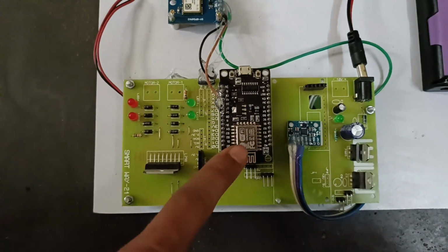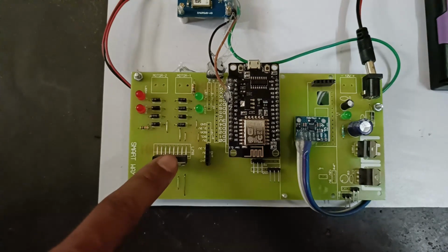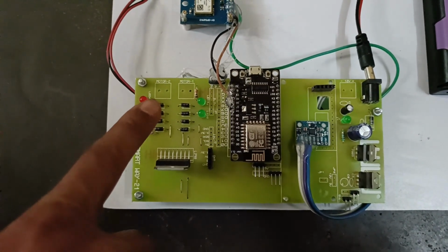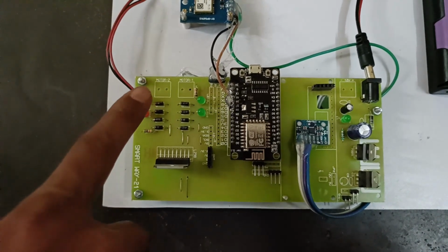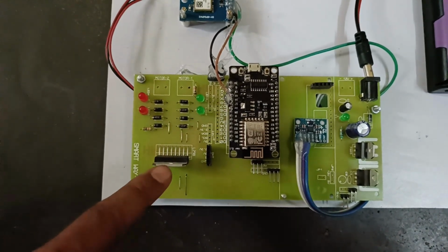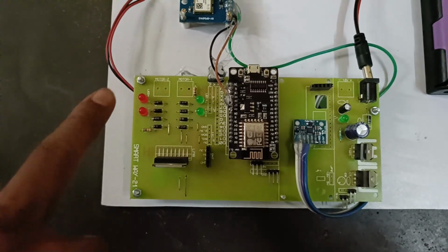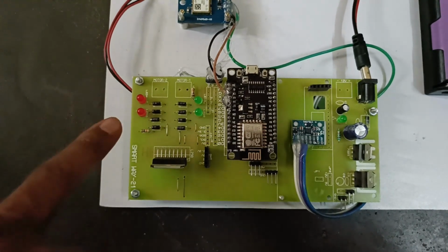The data 2 is sent to the L298N motor driver, and it performs the rotation of the wheels. We have designed it for rotation in only forward and backward, for the right side wheel and left side wheel accordingly. So the value 2 makes both sides, left and right, rotate in the forward direction.